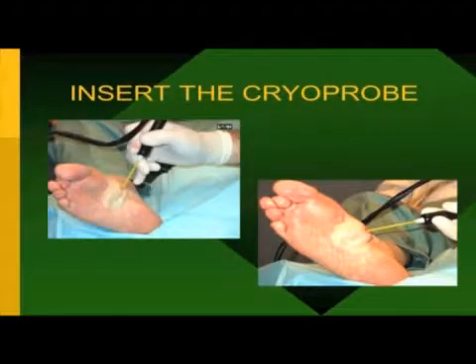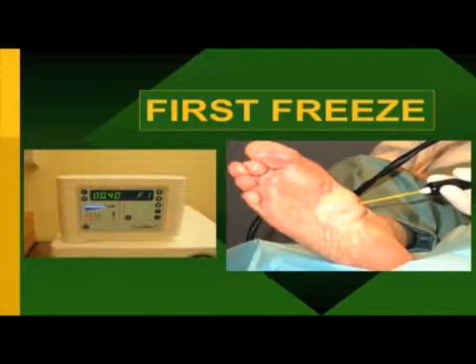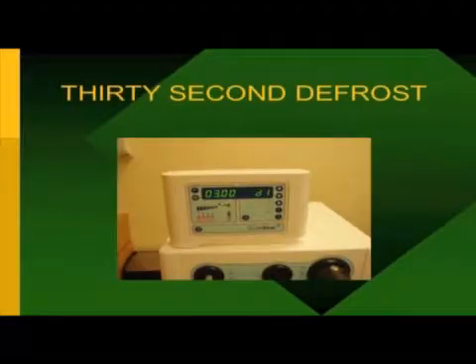The machine requires an assistant to press some buttons and hit a foot pedal during the procedure. The machine is set for two minutes per freeze for fibromas, three minutes for some other procedures depending on probe size. You do a freeze, then wait for a defrost cycle of about 30 seconds. So for a fibroma: two-minute freeze, 30-second defrost, two-minute freeze, 30-second defrost. Even doing 12 freezes on a patient is approximately a half hour of time.